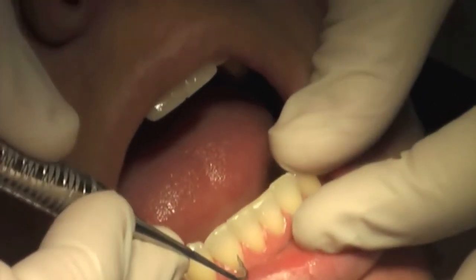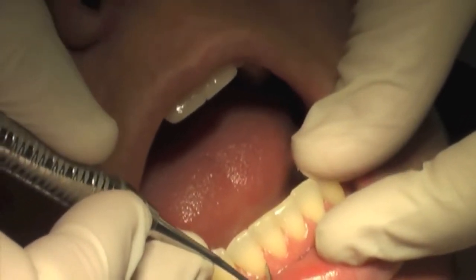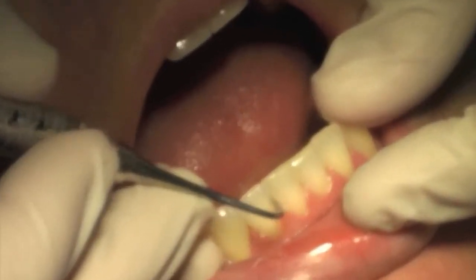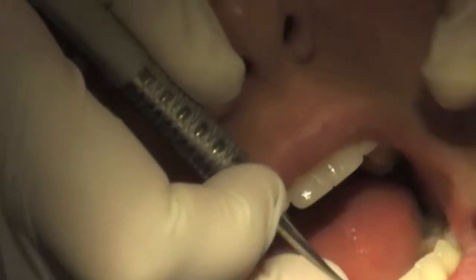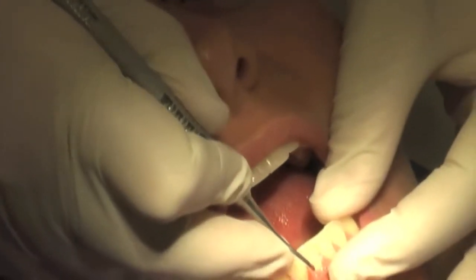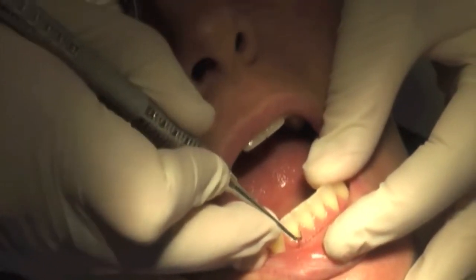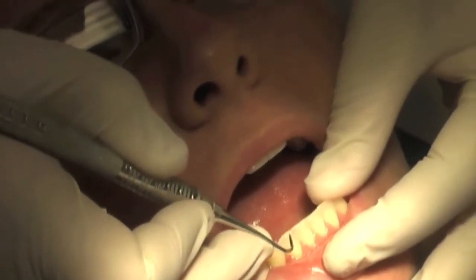Some people ask me: are you just pointing the toe right at the tooth? I'm not. I'm using just microscopically the tiny top third of that instrument. That's the thing that's kind of hard to keep in mind. I'm also staying in the V of the hand grasp here, and I'm staying parallel with the long axis of the tooth. Sometimes I lean it a little bit so I can get the correct blade relationship to the tooth.